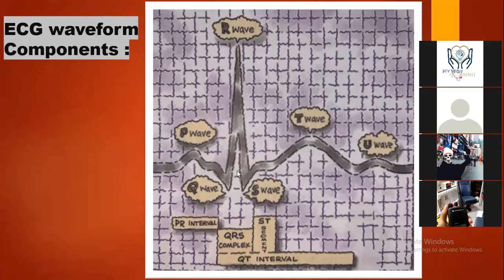Okay, so as you can see here, guys, this is the ECG waveform components.